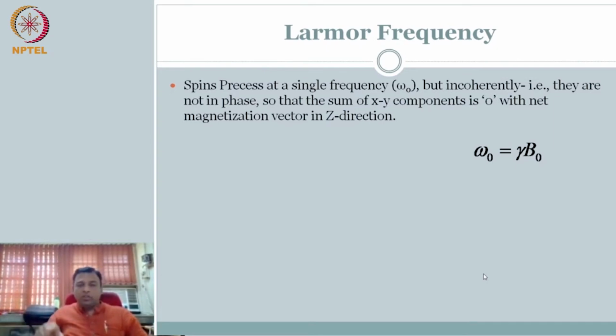Each one is a microscopic magnetization vector in different directions. But pretend now I am subjecting this to an external magnetic field, right? And let's say that is my voice command saying, everybody align the spin in the direction going from floor to roof.